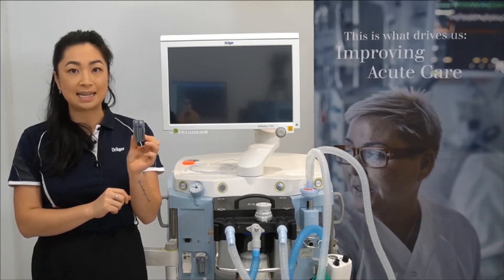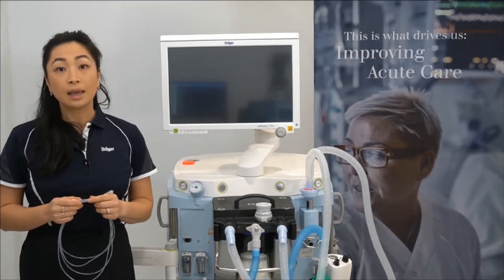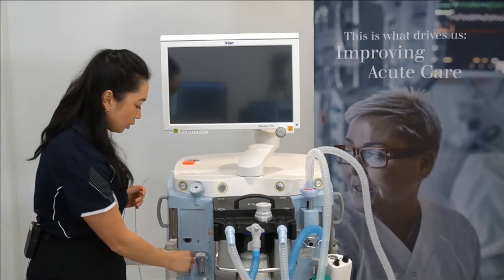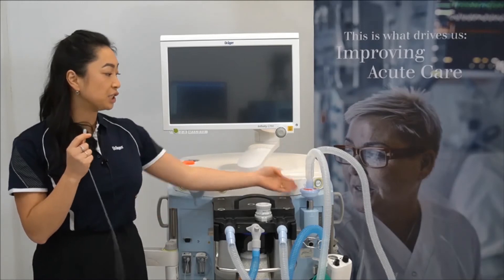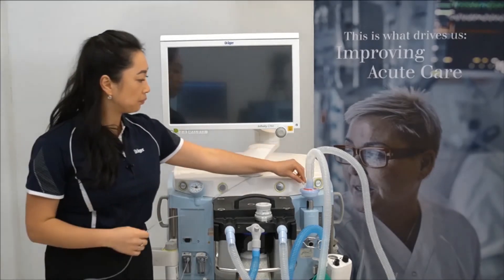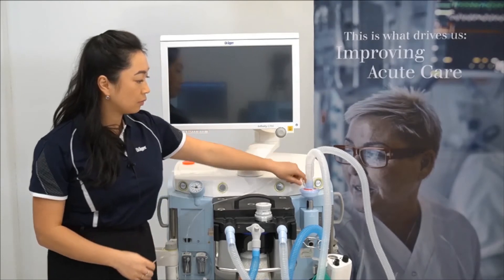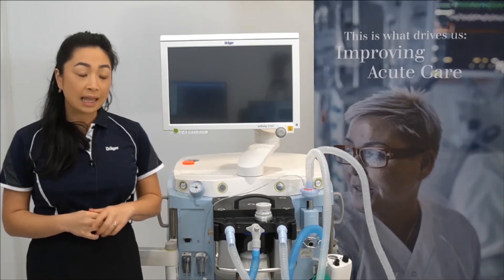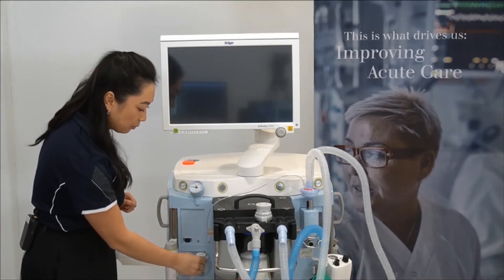The water trap should be checked on a daily basis and exchanged every 28 days. To attach the gas sampling line, one end connects to the CO2 water trap and the other end to the machine side of the filter. Please refer to your hospital guidelines for changing intervals. Then for the protect water trap, connect the internal sample line.